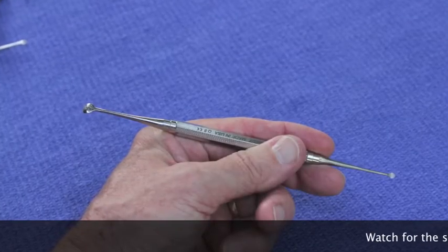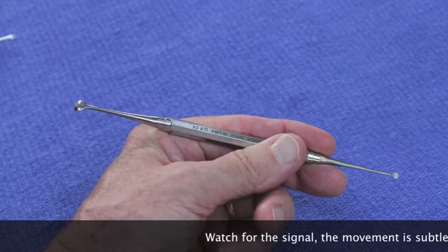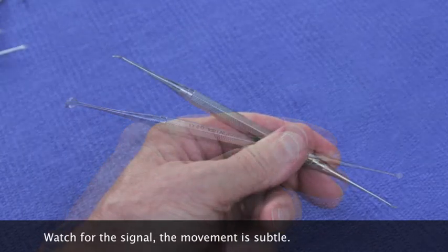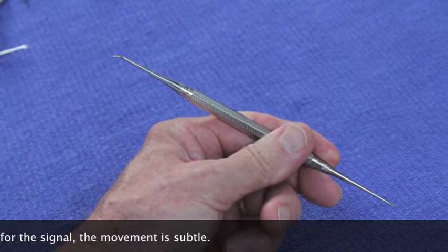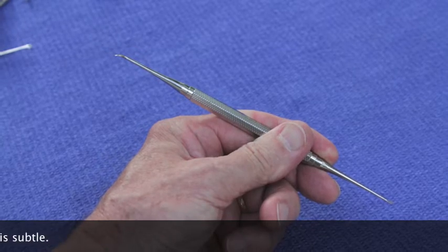When the doctor requires a new instrument, he or she will give a signal by a subtle movement of the instrument away from the palm of the hand. This will tell the assistant that it's time to transfer the instrument that they are holding for the one that the doctor is holding.